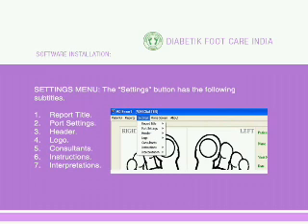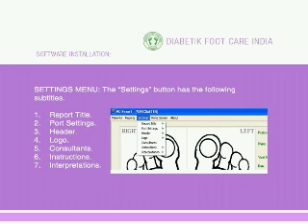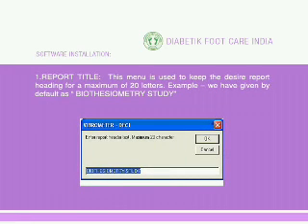Settings Menu: The Settings button has the following subtitles — Report Title, Port Settings, Header, Logo, Consultants, Instructions, and Interpretations. The Report Title menu is used to set the desired report heading for a maximum of 20 letters. By default, it is set as 'Biothesiometry Study'.